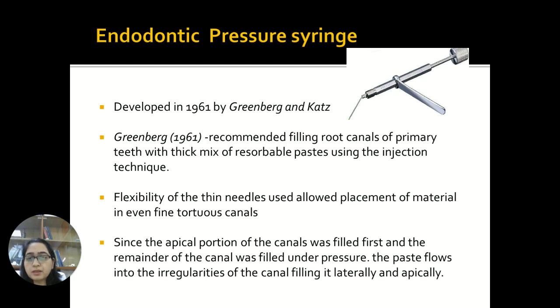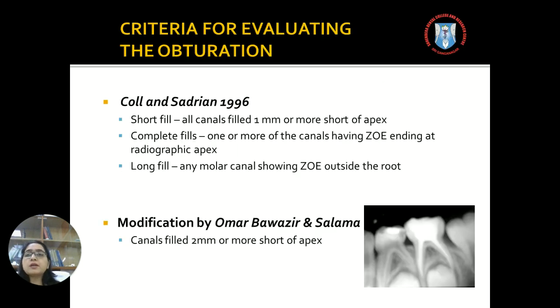It was developed by Greenberg and Katz in 1961. Greenberg recommended filling of the root canals with a thick mix of resorbable paste using this injection technique. The flexibility of the thin needles which are used allows the placement of material to the apex and even in fine tortuous canals. Since the apical portion is filled first and the remaining canal is filled under pressure, this flows regularly into the irregularities both laterally and apically.